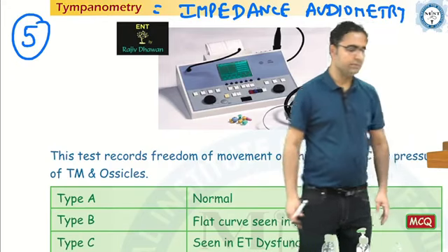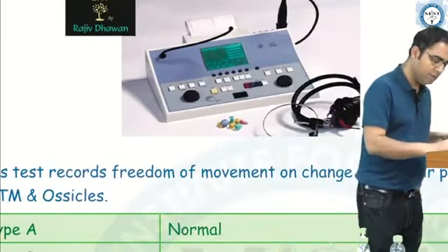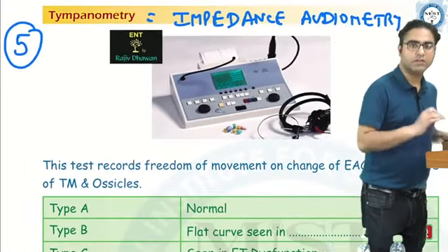Now, this is the tympanometer. What is the function of this test?